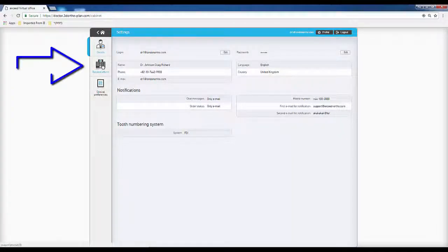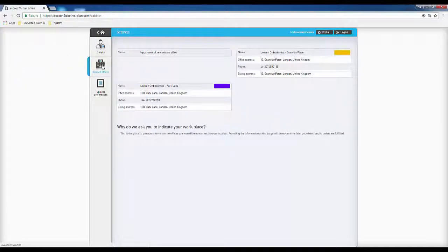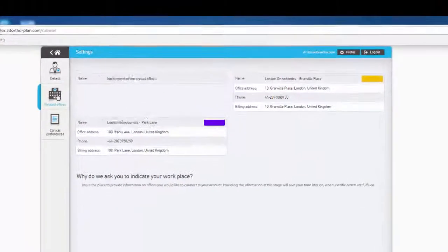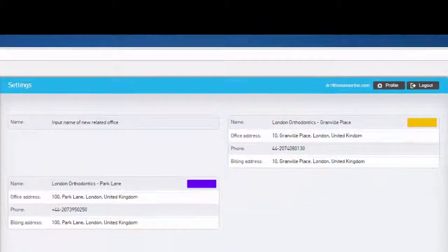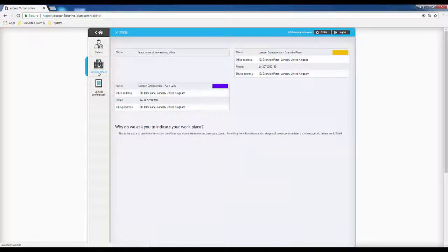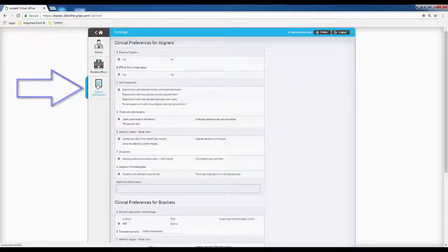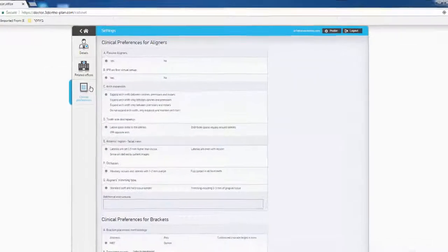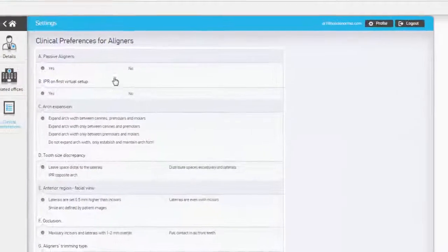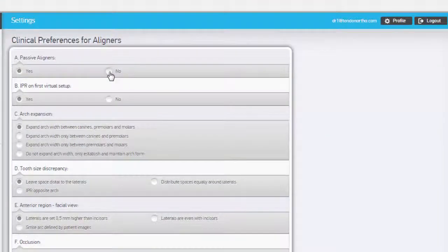The Offices section includes details on locations associated with the account. Finally, the Clinical Preferences page provides general guidance on treatment strategies.